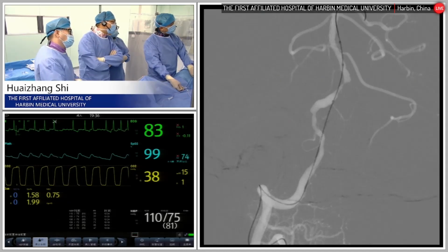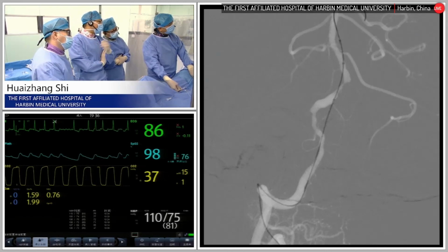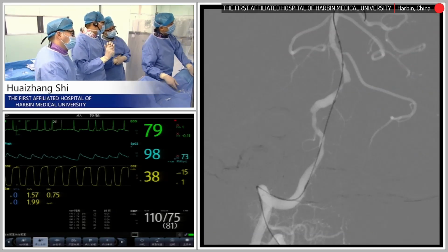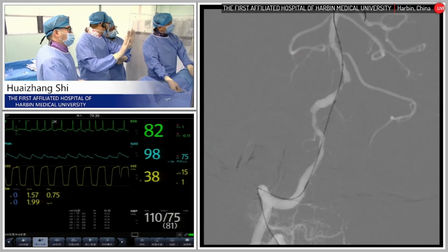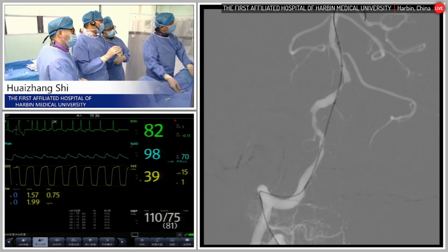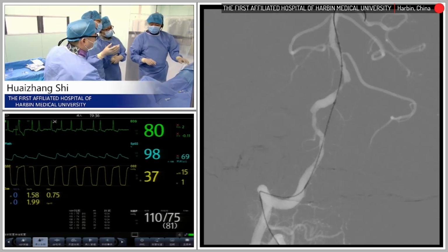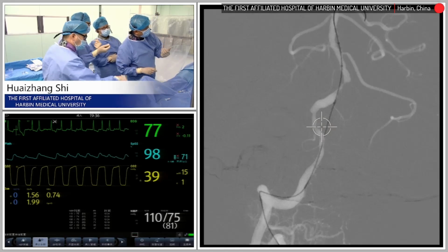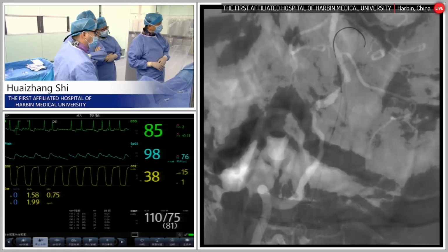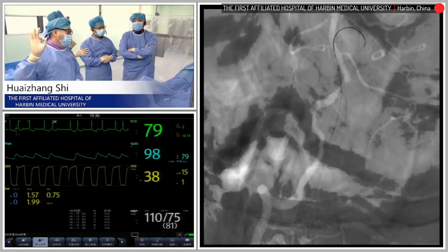Yes. Okay. Let me pull back a little. Be careful, because sometimes in angiography the pressure is very, very high, so it may puncture the vessels. I see. We put the balloon at the lesion. We need to make an angiography and maybe withdraw. Okay, go now, angiography.